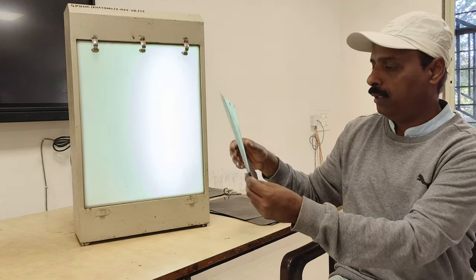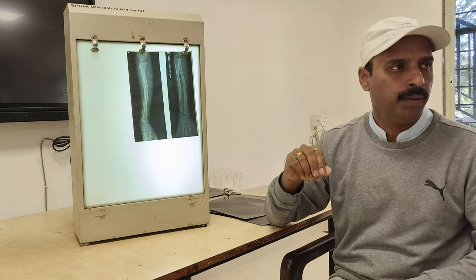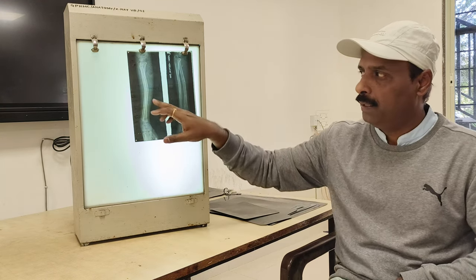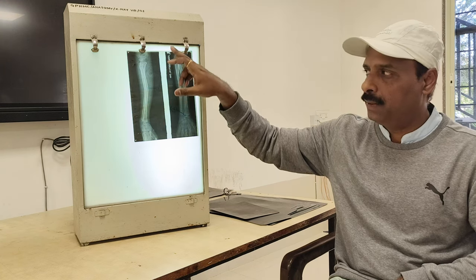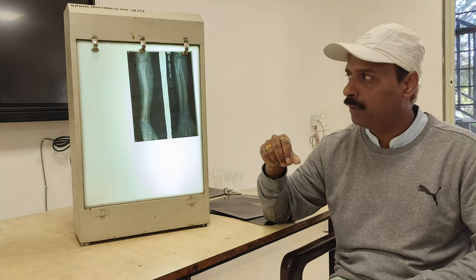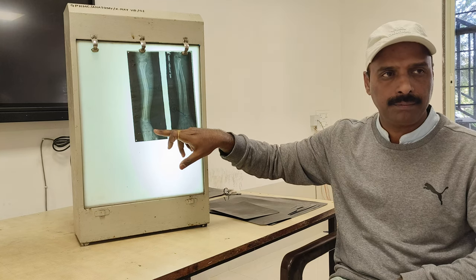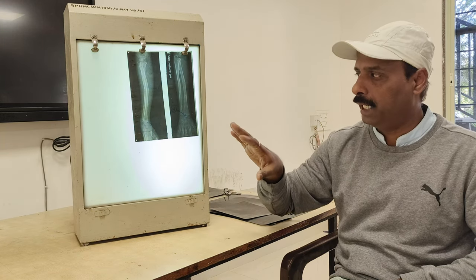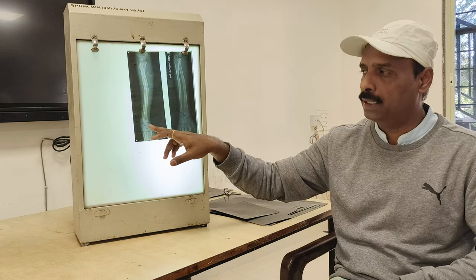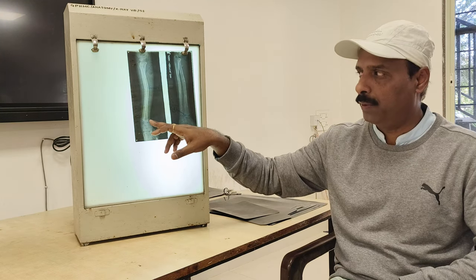Next we are going to remember an abnormal x-ray, and I am going to show how to identify a fracture on x-ray. Here is a fracture of the radius and ulna. This is a forearm x-ray taken including the elbow and wrist joint. It is a plain x-ray, and we get an anteroposterior view and a lateral view.